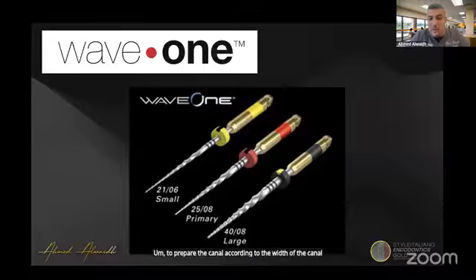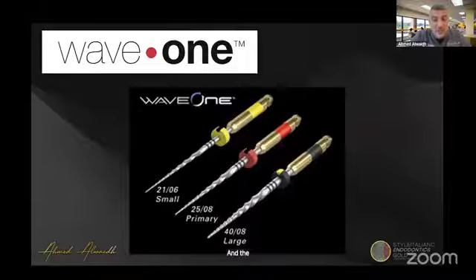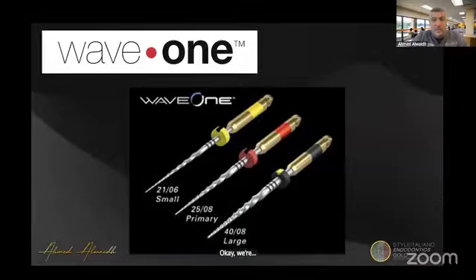So you have the small, primary, and large. Small is size 21, taper 6, and primary size 25, taper 8, and the large was size 40, taper 8. You can see that the taper is very big. We're talking about taper 8.